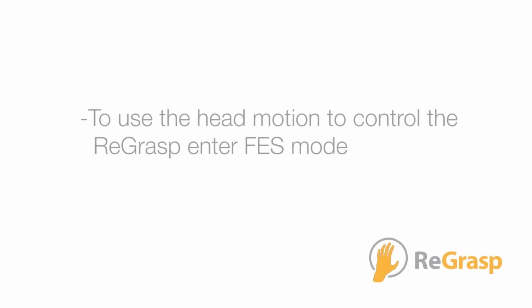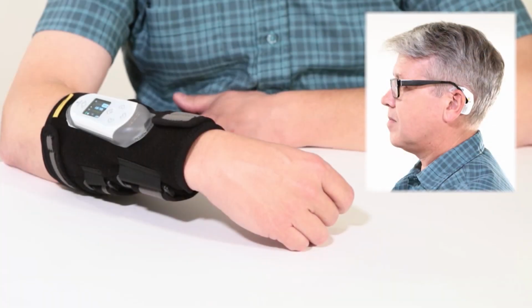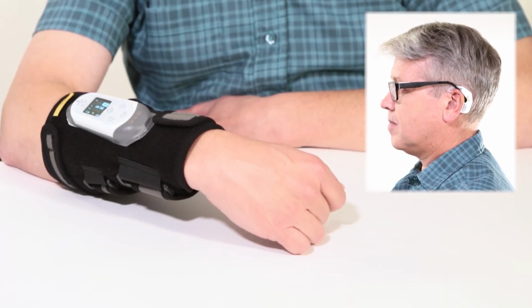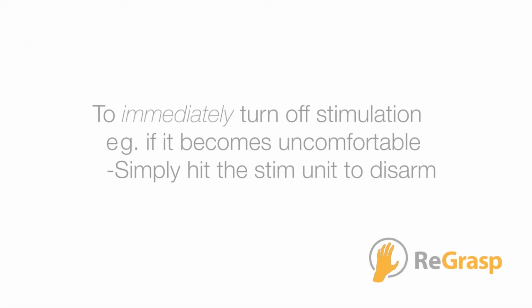To use the head motion to control the ReGrasp, enter FES mode. Using the head motion you selected, you can open, close, or relax the hand. If you need to immediately turn off the stimulation, for example, if the stimulation becomes uncomfortable, simply hit the stim unit and it will disarm.